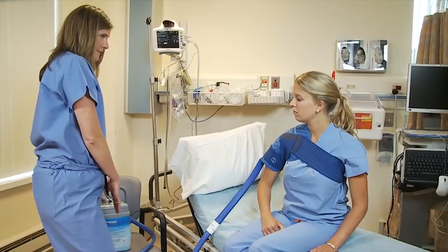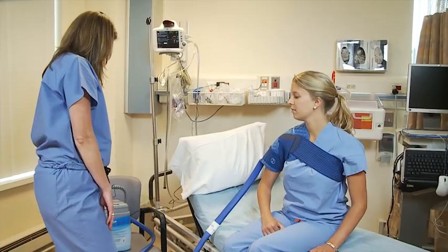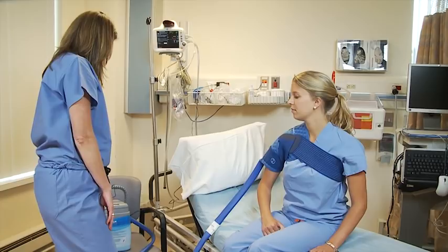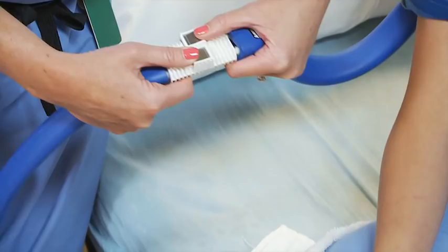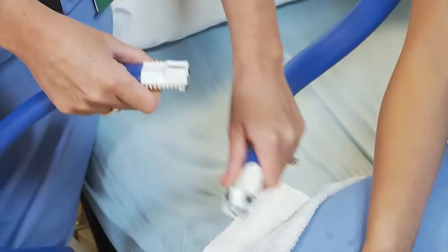When it's not in use, you want to unplug it to disconnect. You want to have a little towel nearby. To disconnect, you want to press the metal clips and pull apart. There'll be a few drops of precipitation but then it will stop — there's a valve inside so it will stop. When not in use, you don't want to leave the motor running. You either unplug it from this or from the wall source.